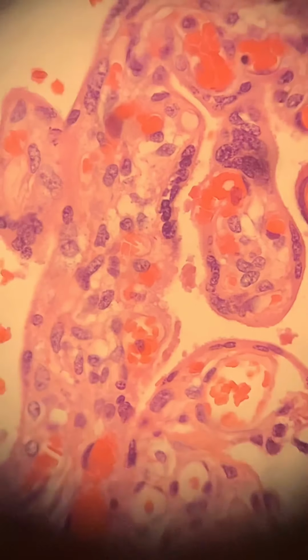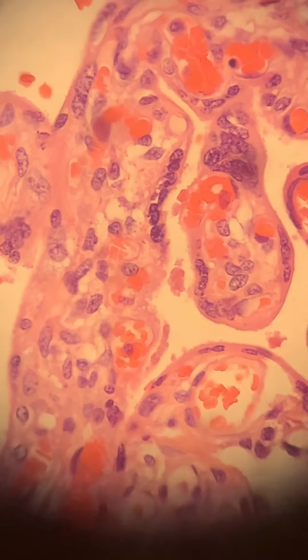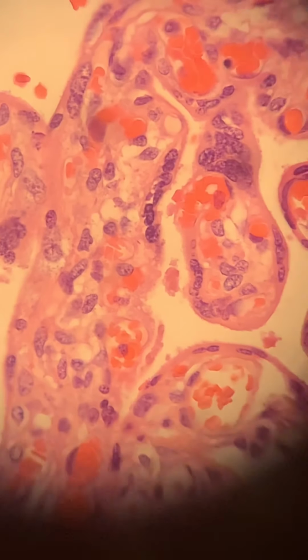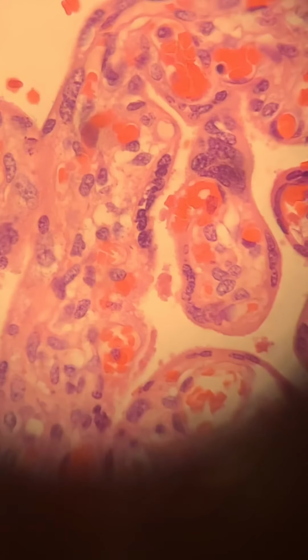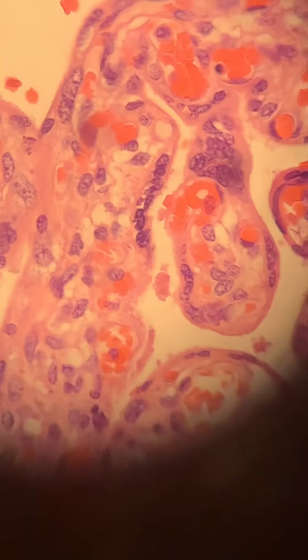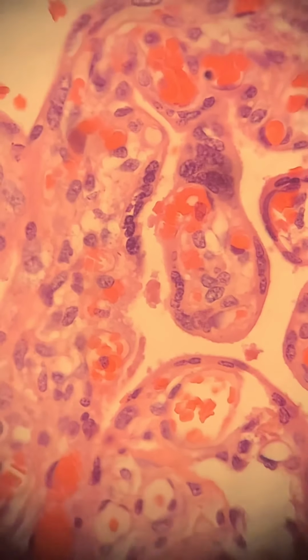So before I start cruising around, this is the placental body from twin B. If you look at 12 o'clock, you see the nucleated RBCs within the fetal blood vessels. You also see some villus edema, and there is slight fibrosis. So it wasn't a great deal of it.